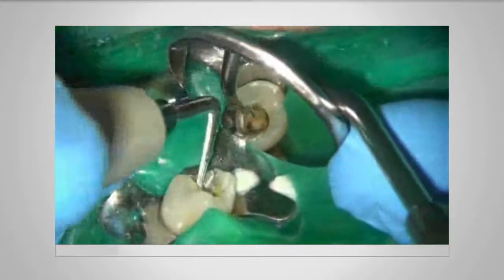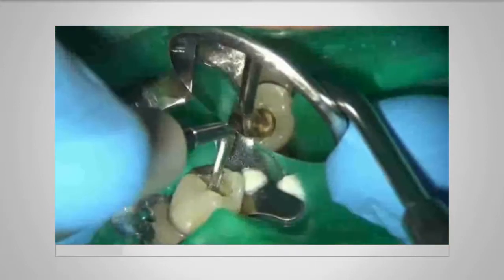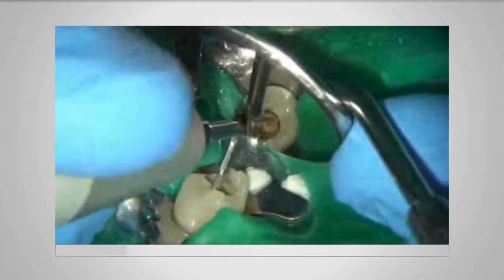There we are, so continuing to remove cement from around the pieces of broken instrument.